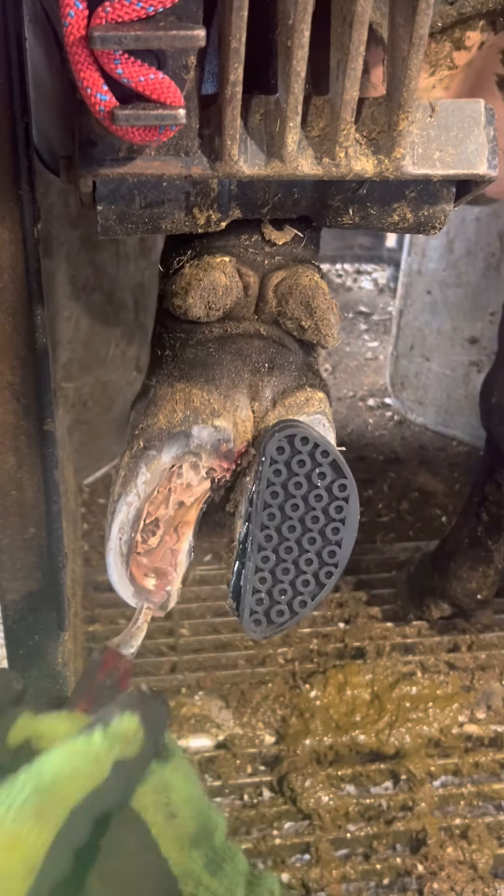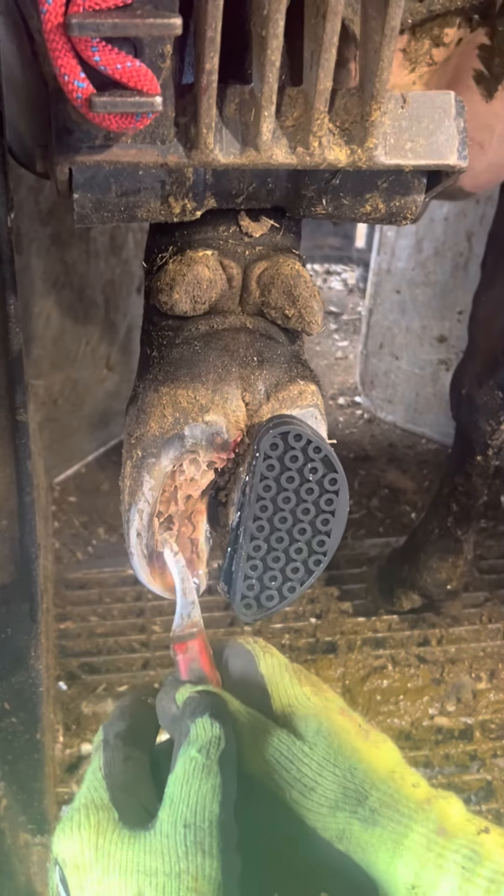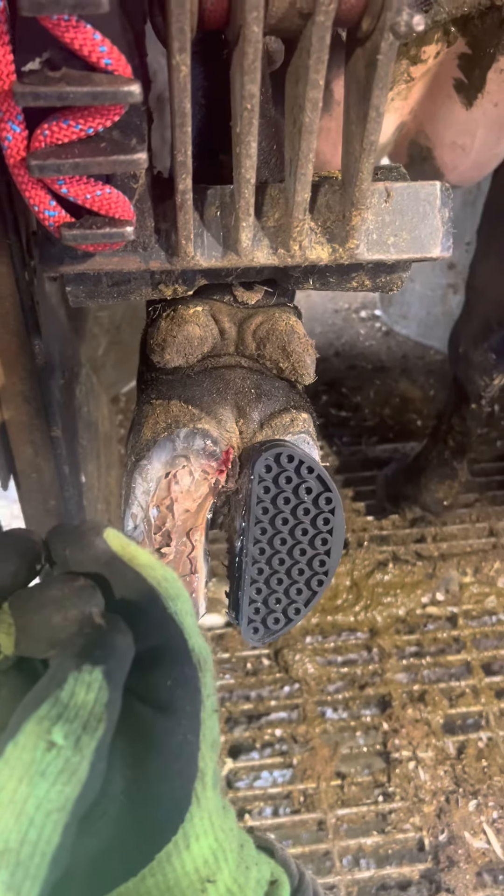As I cut to the outer part of the wall there, it's a little bit harder of hoof so it doesn't cut away as nice. I know this looks painful but she needs this done so that she can start healing properly.